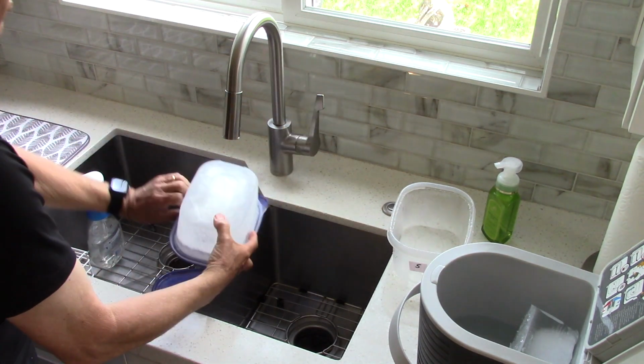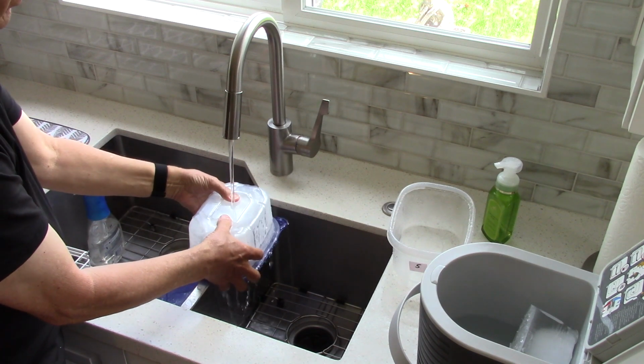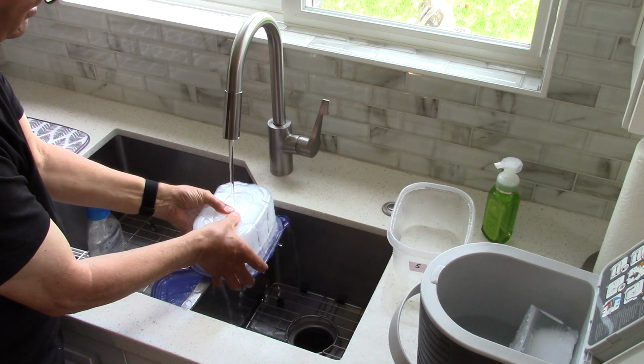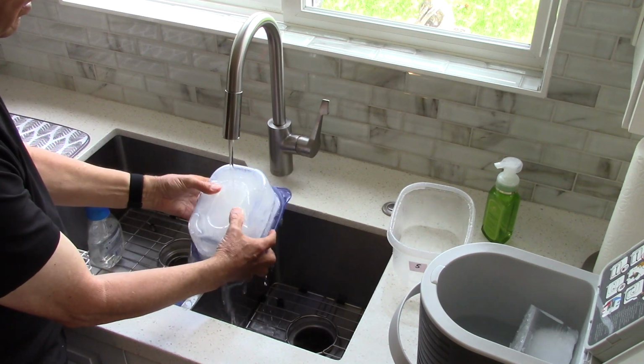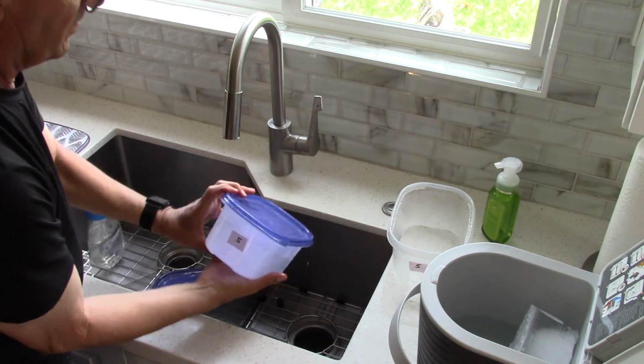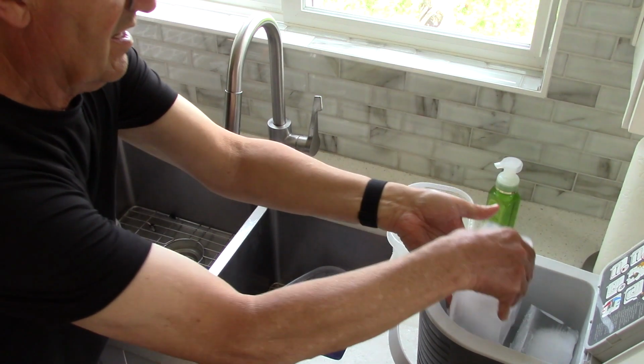And we'll go ahead and do a second one. And we should hear a drop real soon here. Certain ones take a little bit longer to drop than others. There we go. Let the water fall. Pop the cap, throw it out, and set it in there.